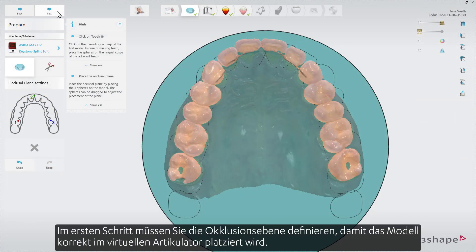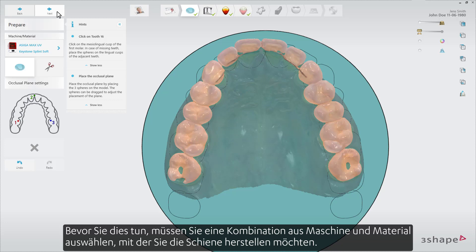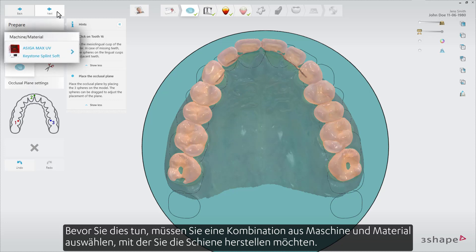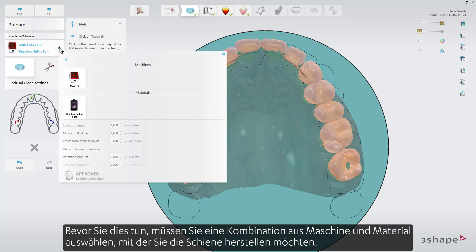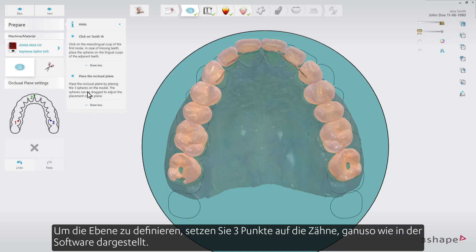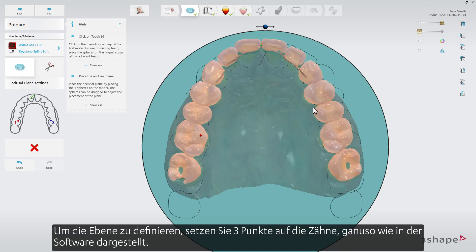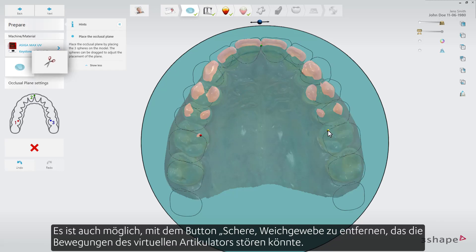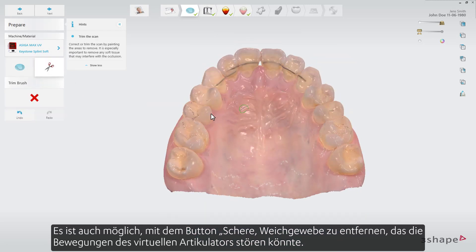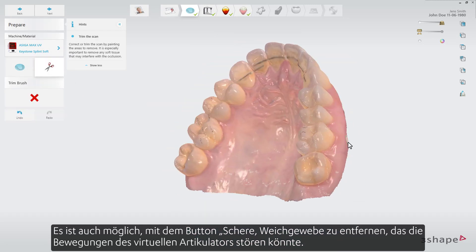In the first step you need to define the occlusal plane so that the model would be placed correctly in the virtual articulator. Before you do that you need to select a machine and material combination that you will use to produce the splint. To define the plane, put a set of three points on the model as per the instructions shown on the screen. It is also possible to use the paint tool to trim away any soft tissue that could interfere with the motions of the virtual articulator.